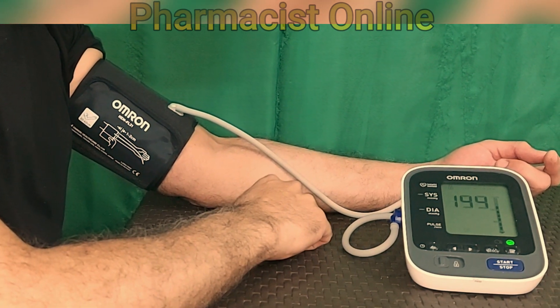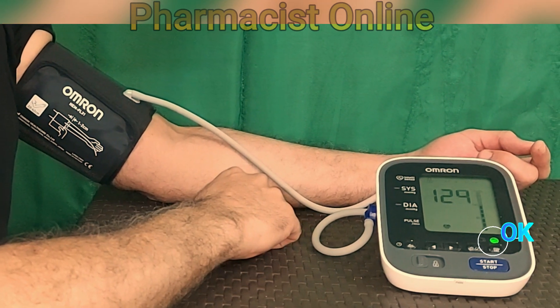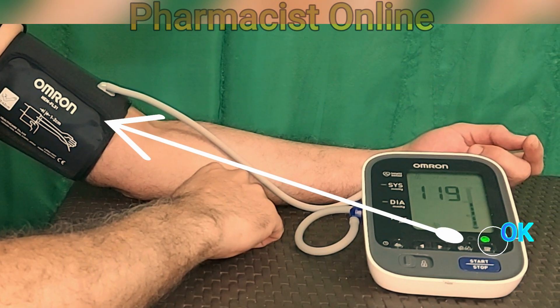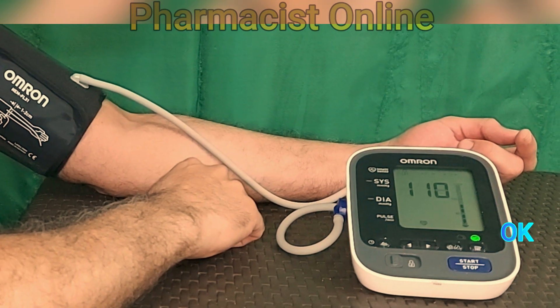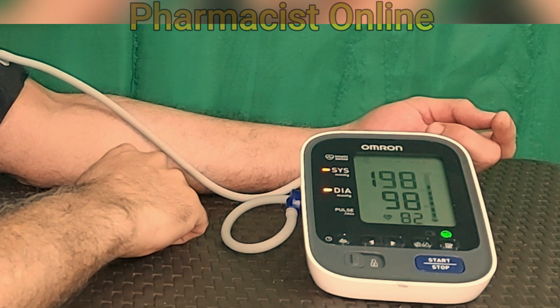You will also get the pulse rate here. The OK green button on the device indicates that the arm cuff is wrapped correctly. If it is too tight or too loose, the color of the OK button will be yellow or red.